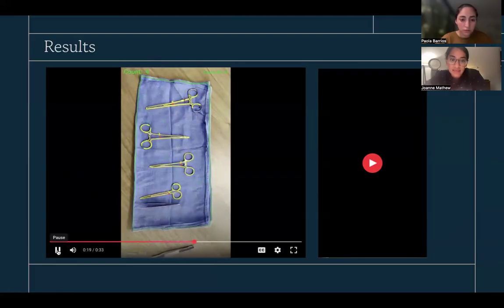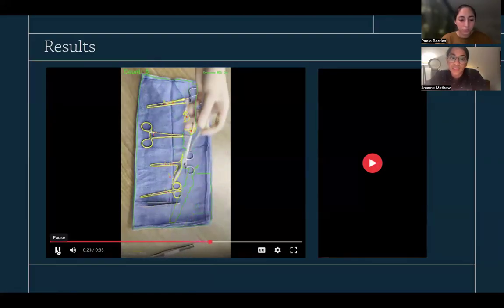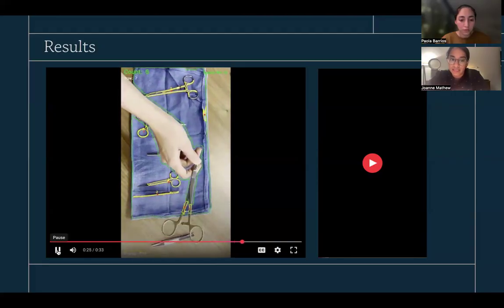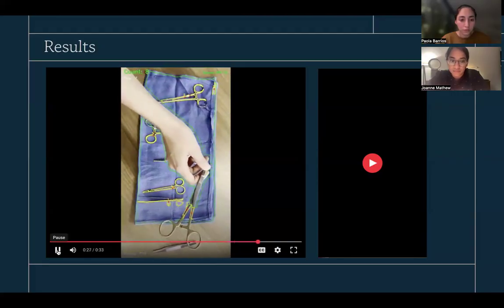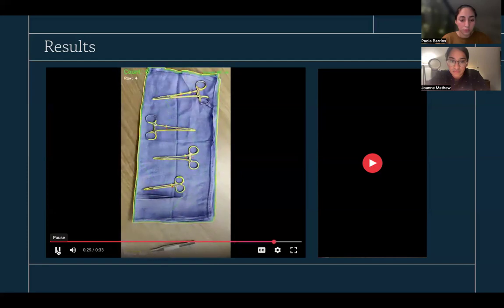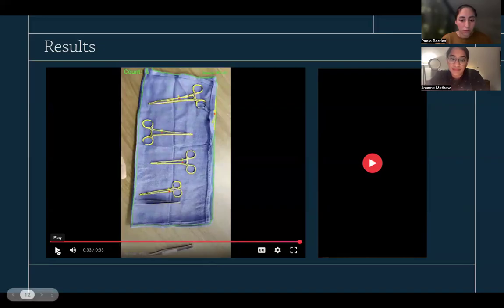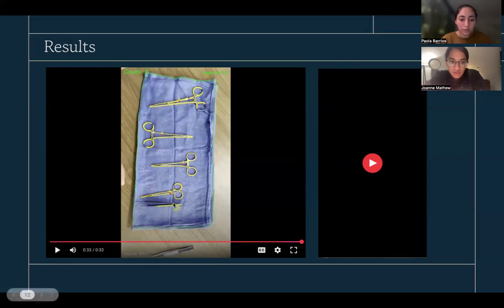The green outline stays around that region of interest and changes every few frames, because the video itself is moving, but it keeps updating itself. What we really want to focus on is the count at the beginning and the end, which stays pretty accurate, as you can see. Occasionally, as we do see, sometimes it does miss or count the edges as an object, but overall it does a good job.